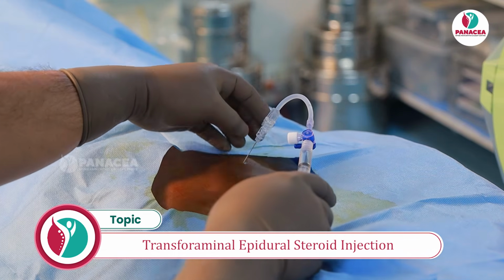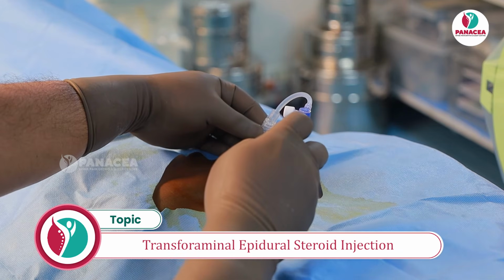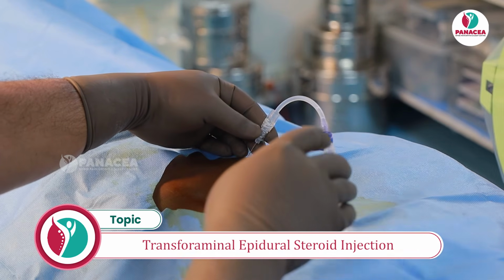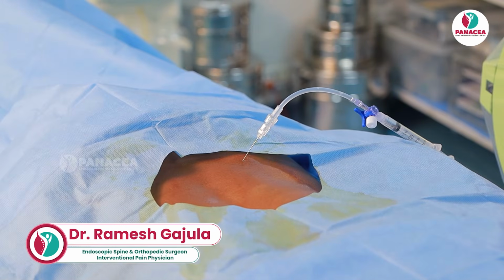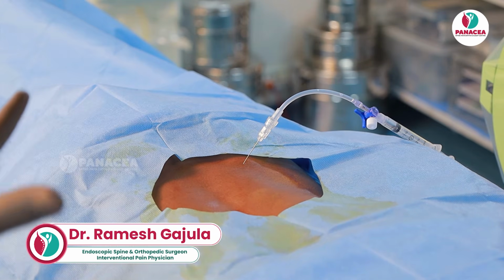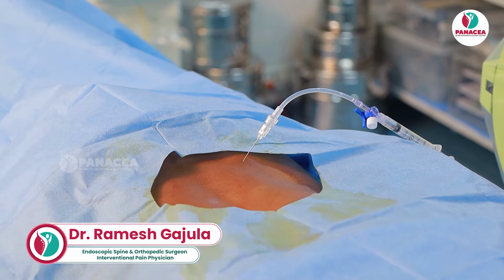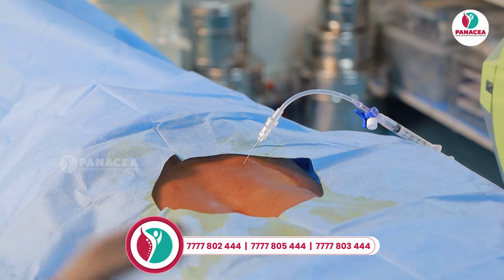And once the target area is reached, I am injecting only 0.2 ml. Why? Because I am not sure that my needle is exactly at the target area. So if I give too much dye, the area can get obscured. If I want to do a redo procedure, then your fluoro should have at least digital subtraction facility.